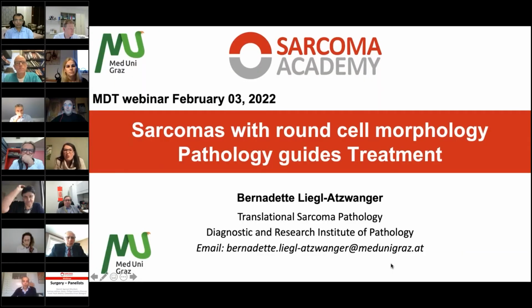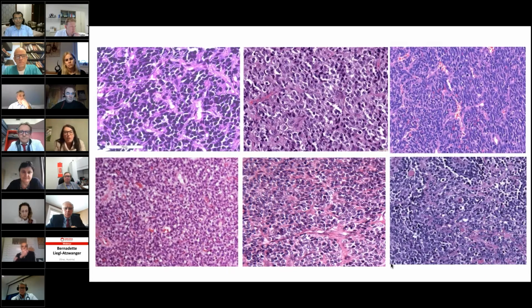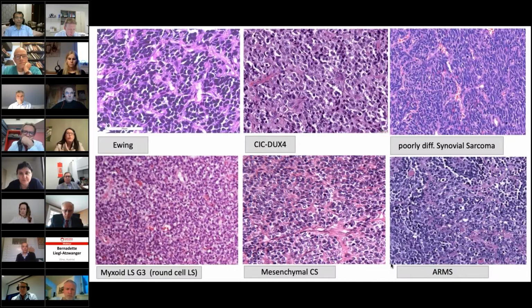Well, thank you very much for inviting me, and you told me that I can choose to describe a case or to go more in detail of one part of pathology. I decided to talk today a little bit about sarcomas with round cell morphology, because I loved the talk Beata Bode gave last time about the myxoid lesions. And I thought I will talk today about round cell lesions and some diagnostic issues we have in pathology to solve these lesions.